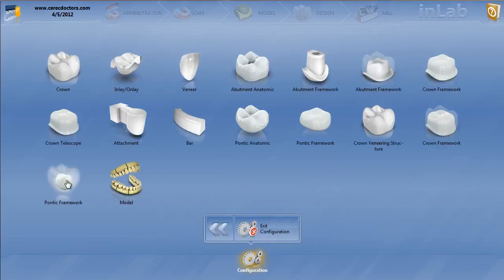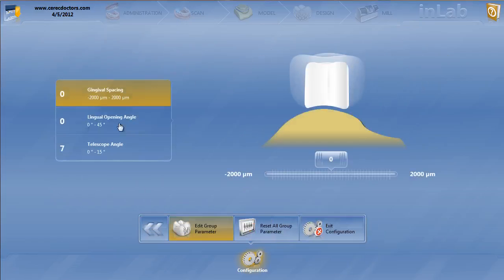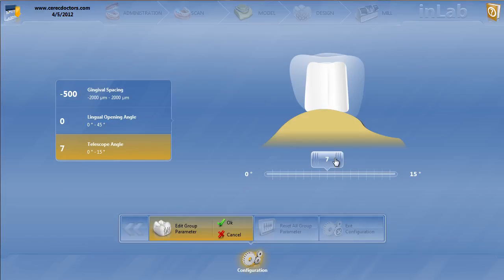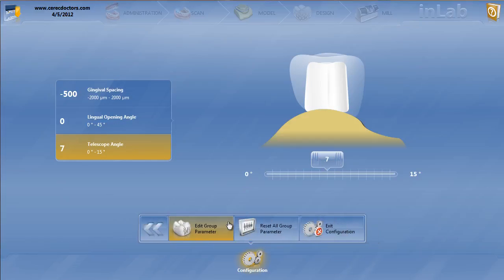And for the pontic frameworks, that's pretty simple. We don't have anything underneath there, no spacer. But what I will do is generally I'll push this a little bit negative for the gingival spacing. No lingual opening angle. But I also will give it just a bit of a telescope at about 7.